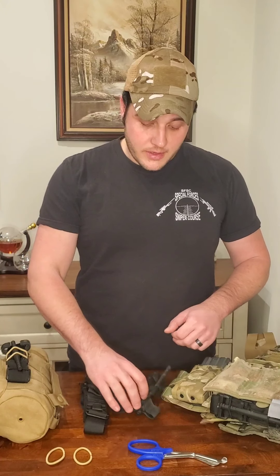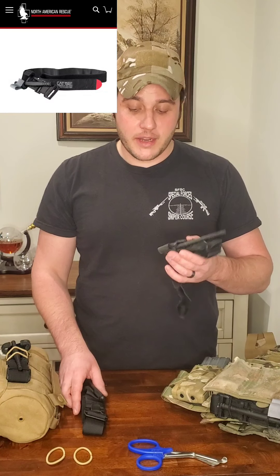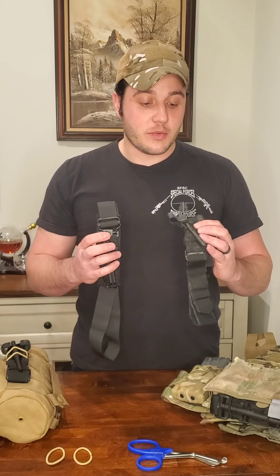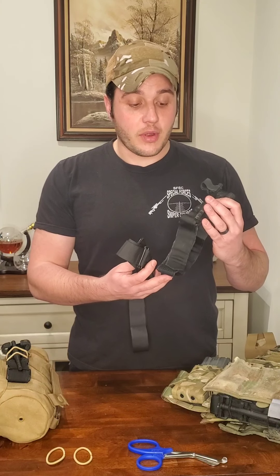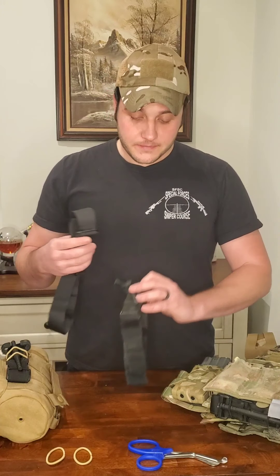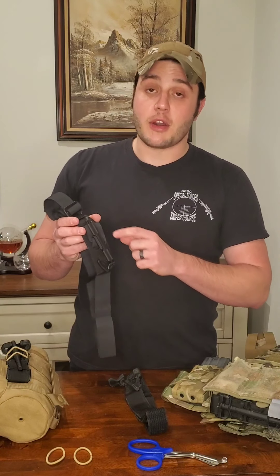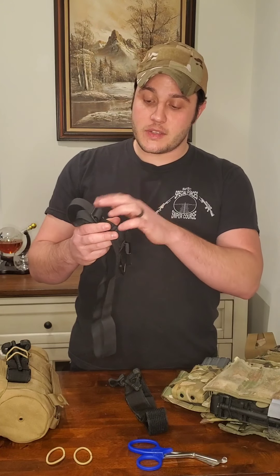I have a couple different versions of tourniquets here. I have a CAT tourniquet from North American Rescue and a Soft-T Wide tourniquet from Tactical Medical Solutions. Neither of these are very expensive. The CAT tourniquet I carried a lot overseas — it has Velcro on the running end and plastic hardware. What I like about the Soft-T Wide from TacMed Solutions is metal hardware, so it's going to be more resilient — all steel hardware means a lot less chance of breaking the windlass or the buckles.